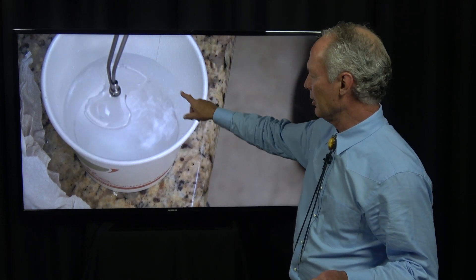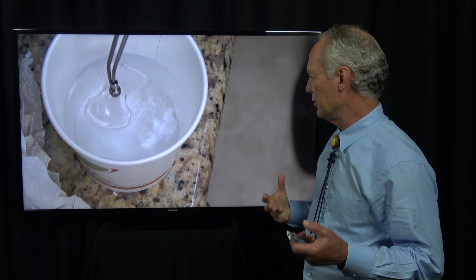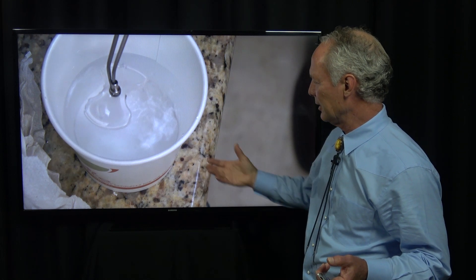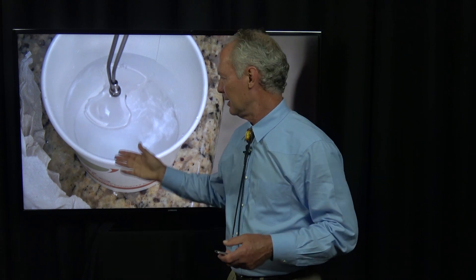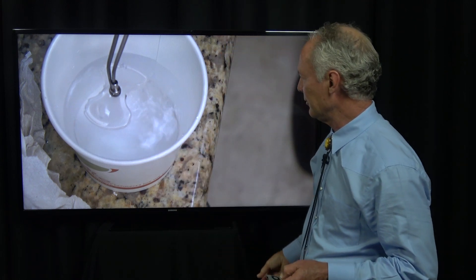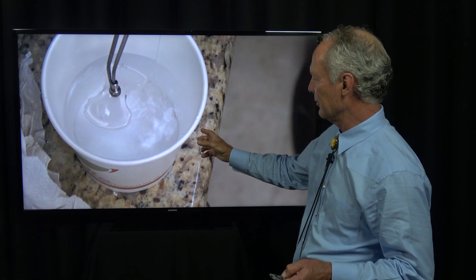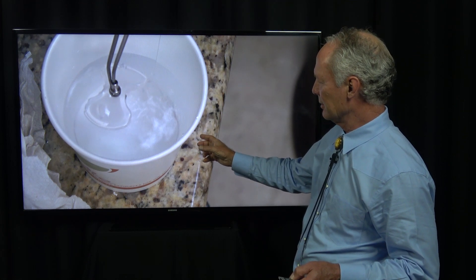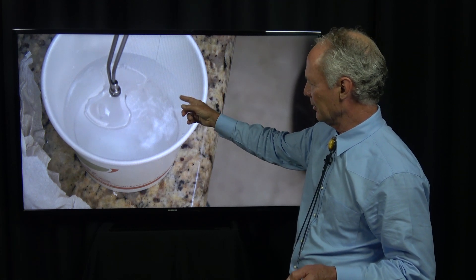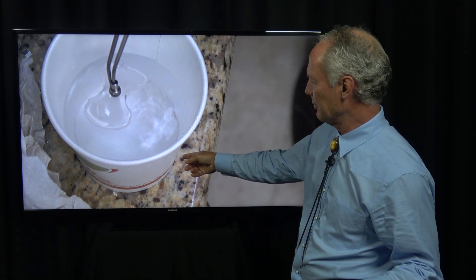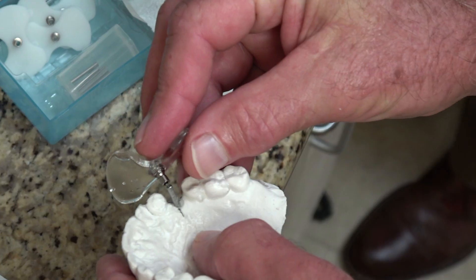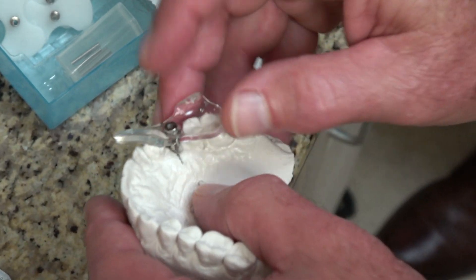Then you put it in boiling water. They give you a boiling pot, but we find that hot water from the water dispenser works fine—just a few seconds is adequate. This is just a paper cup with hot water, not tap water.